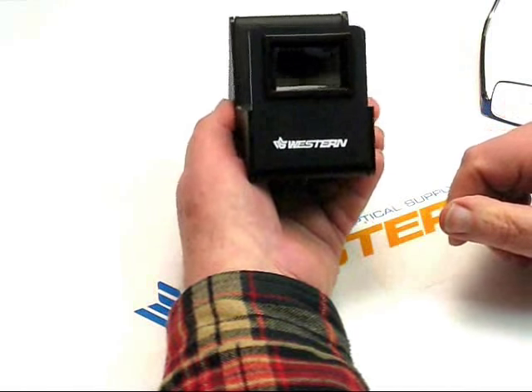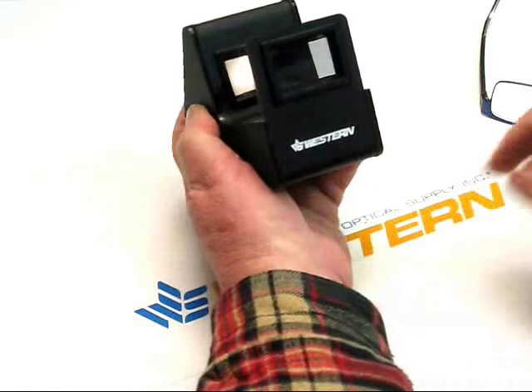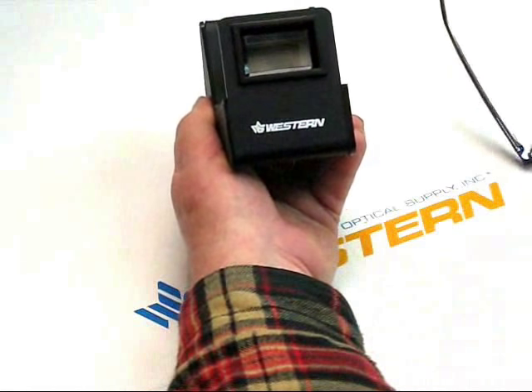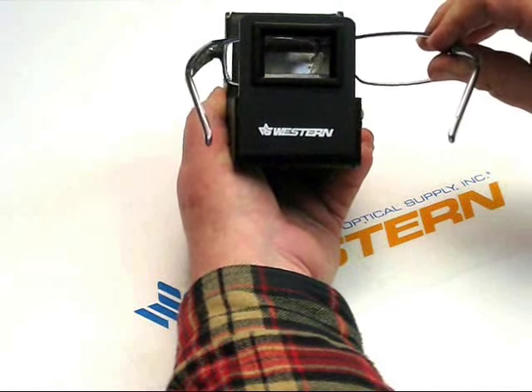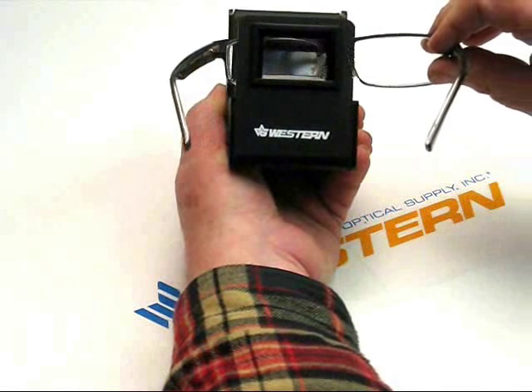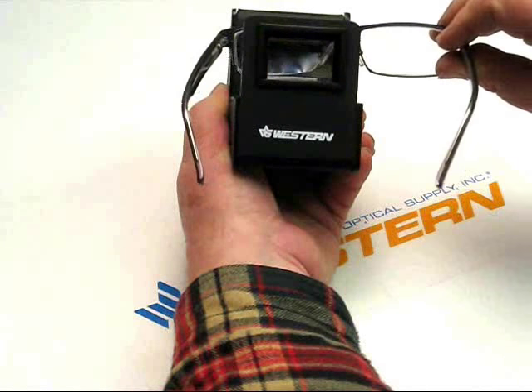When you activate the light in the back, as you may be able to see there, you're able to pass a frame or a lens between the two filters, and then be able to see the stress pattern that appears on the lens itself.